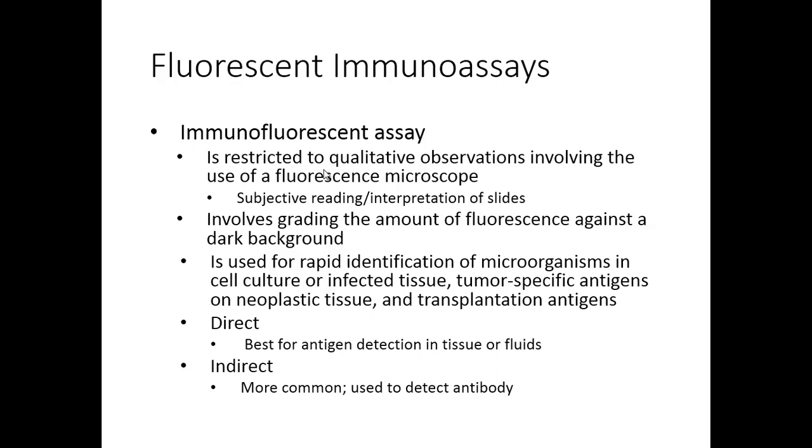All right. Immunofluorescent assays, we're almost done. We're going to look at some immunofluorescent testing later in the semester, but for now, let's take a quick look at it. Fluorescent immunoassays are really just a different kind of immunoassay. Honestly, the key variable is that instead of an enzyme, the detection method is fluorescence. So instead of an enzyme reaction, we're going to look for fluorescence.